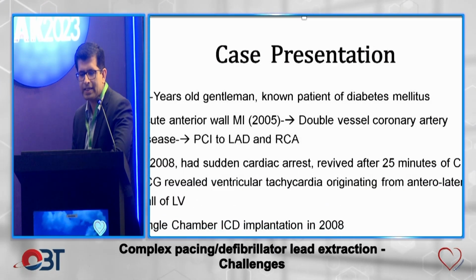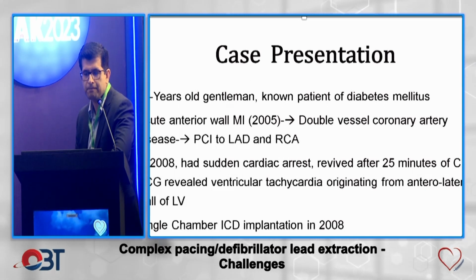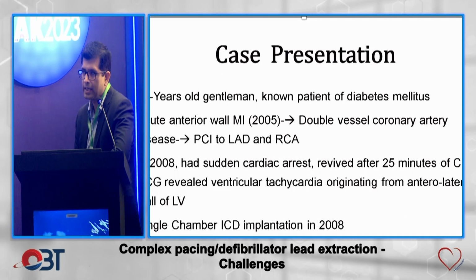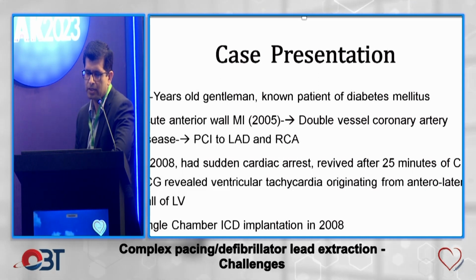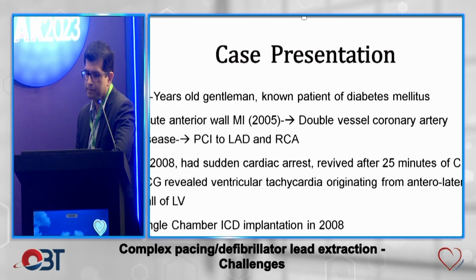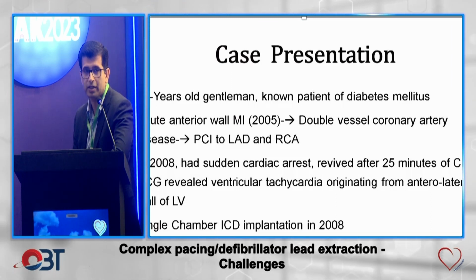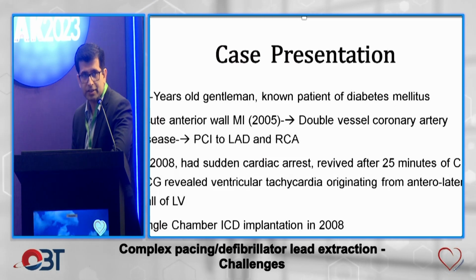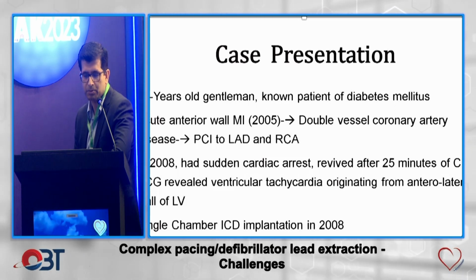In 2008, he had sudden cardiac arrest. Thankfully, he was revived after 25 minutes of CPR, and ECG at the time revealed monomorphic ventricular tachycardia originating from the anterolateral wall of the left ventricle. Now, for secondary prophylaxis of sudden cardiac death, a single-chamber ICD was implanted in 2008.